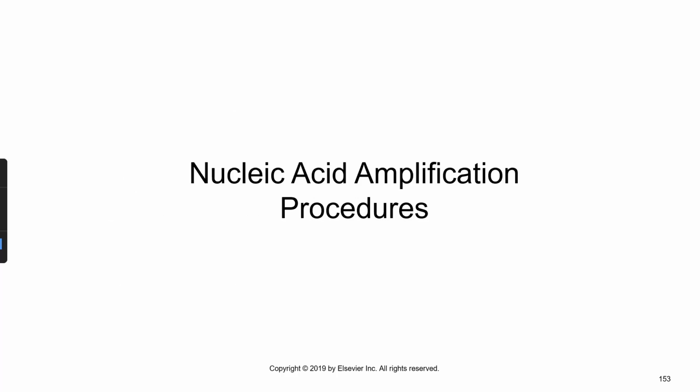So that's one method. We extract the genetic material and we use a probe to specifically find out if that probe will bind to its target sequence. We want the target sequence to be specific for a microorganism, and if we have the probe binding to our patient specimen, we know that it's binding to that specific sequence we were looking for. We know the patient's positive.